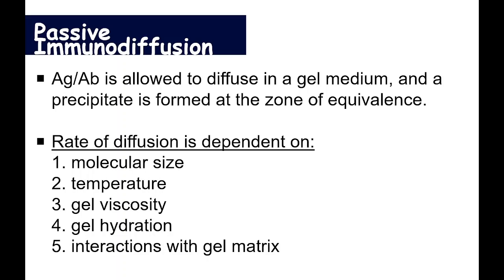If the gel matrix has small areas for passing, then that will impede the movement of our molecules.